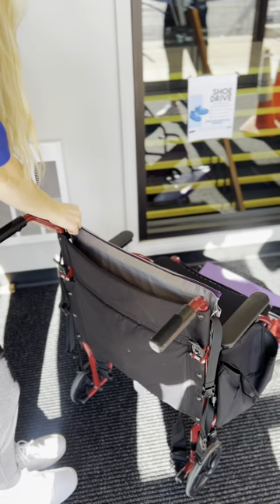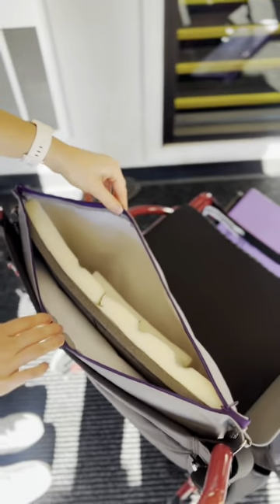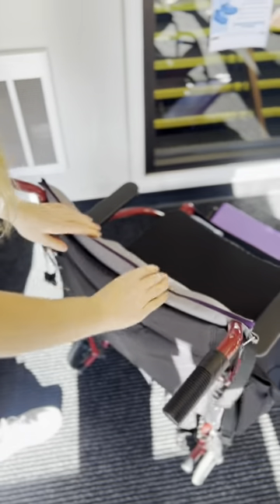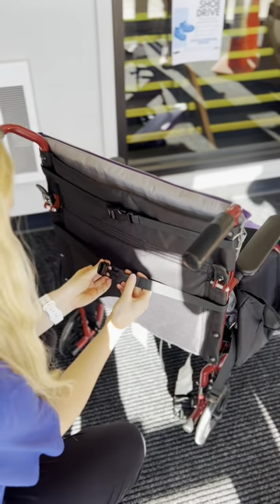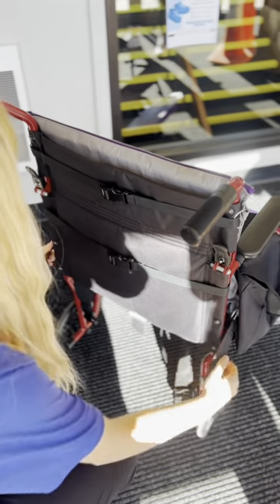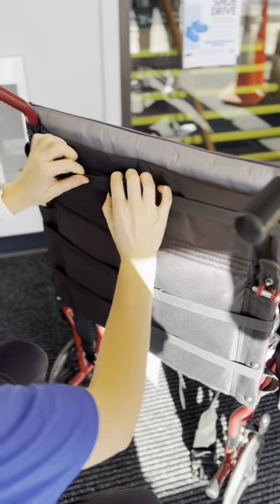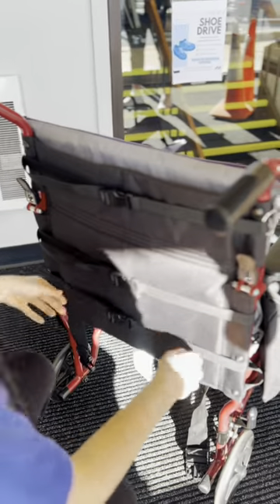The tension adjustable backrest was created using egg crate foam and water-resistant vinyl fabric, with one-inch buckles and one-and-a-half-inch buckled loops for a secure and adjustable fit on the chair. Our client did not previously have any cushions or extra supports in her chair, so the backrest will provide added support to her lumbar back and promote postural stability.